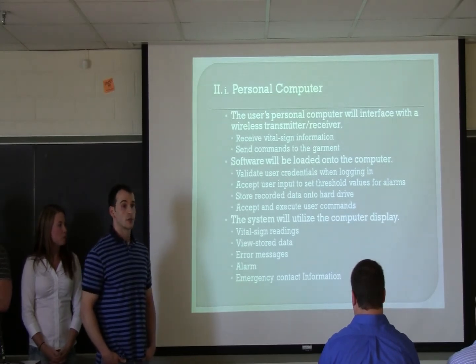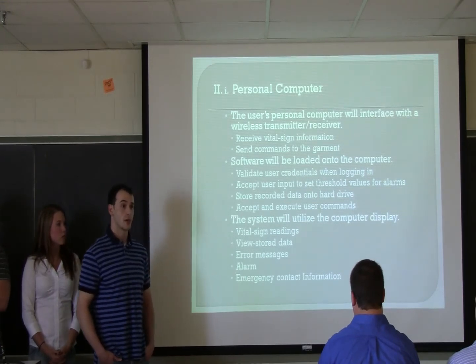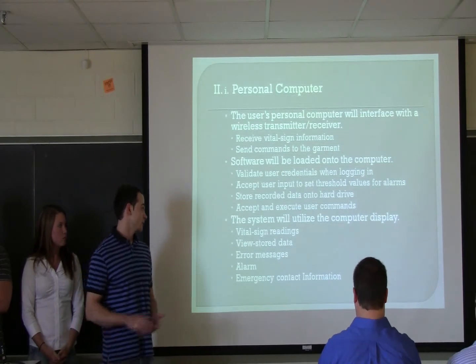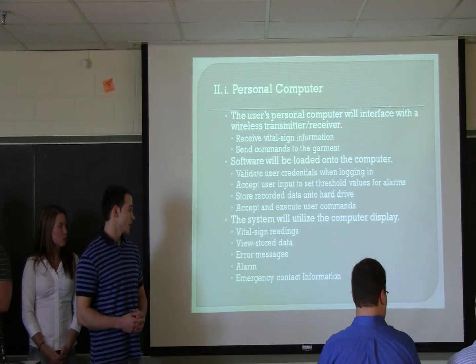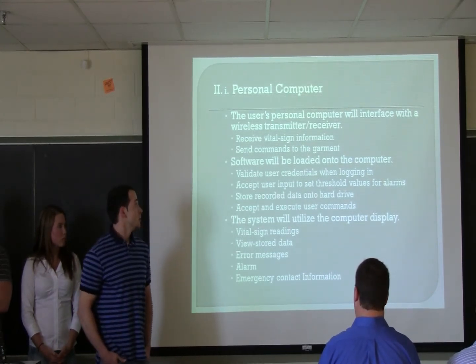And to display all the results and enter the commands, the computer's display will be used for the user. The functions it will do: view vital sign readings, store data, view error messages, alarms, and emergency contact information, so that if the alarm should go off, they know who to contact.